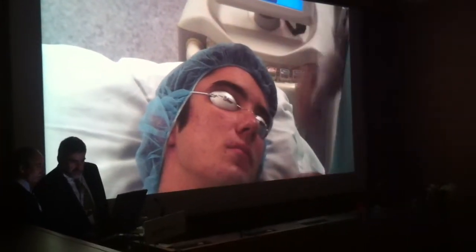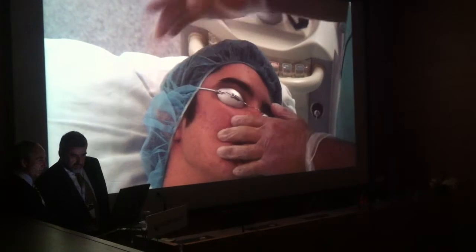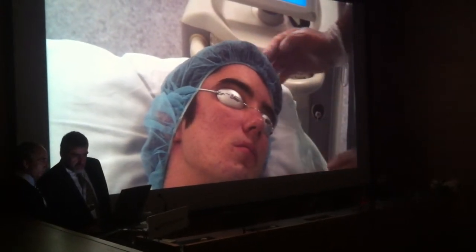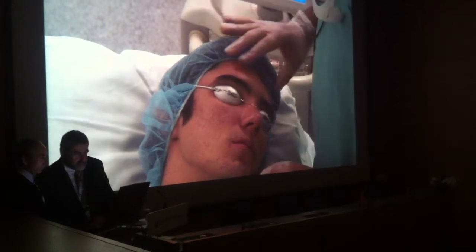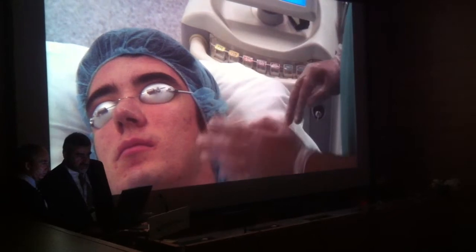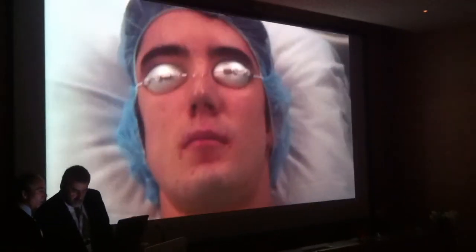Of course, in one treatment, it's impossible to make these scars disappear. We have some areas that will react better thanks to the presence of hair follicles, a good regenerative potential is there. Probably in the upper areas, there are also enough sebaceous glands, but the regeneration is going to be less adequate. So this is why I've already warned the patient that regardless of the intensity of the treatment that we're going to perform today, he's probably going to need further treatments in the future.